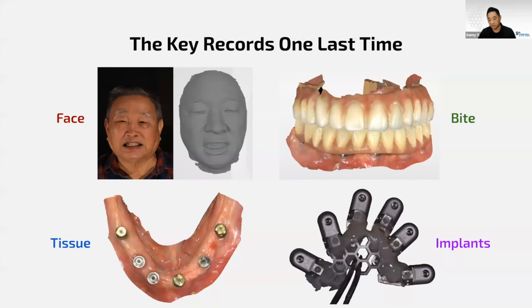And photogrammetry has some of their unique ways that they have to do things. Obviously, their implant records just pop out as healing caps, and you just align those healing caps to the tissue scan. There are different ways for all of these different systems to be able to align this data together. And different clinicians do it differently as well.